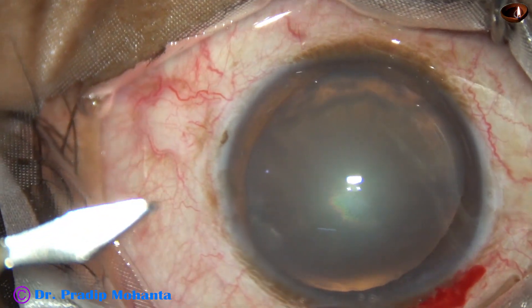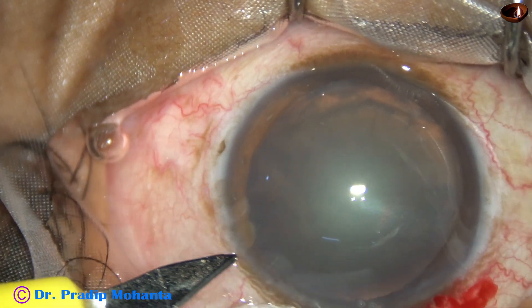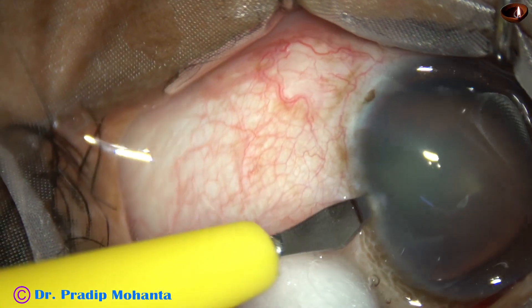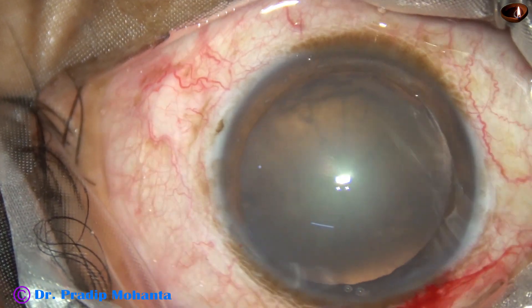A side port is made on the left side of the main incision, about three clock hours away. Only one side port has been made in this case.